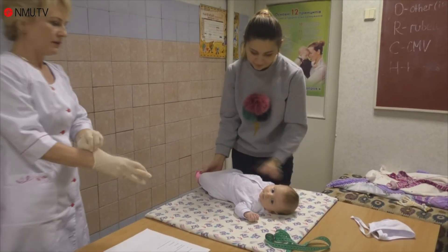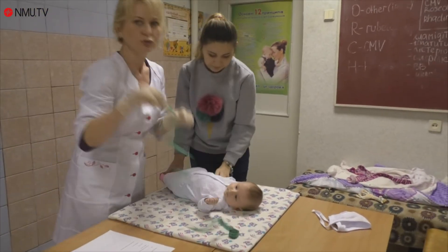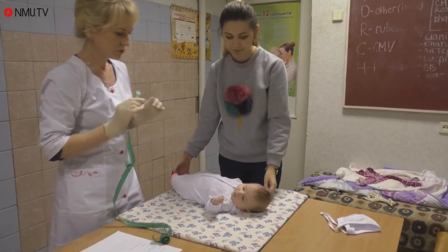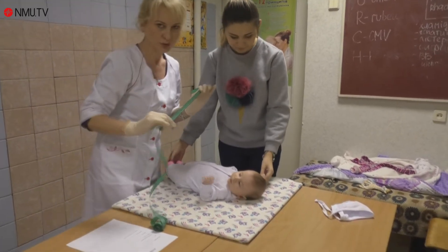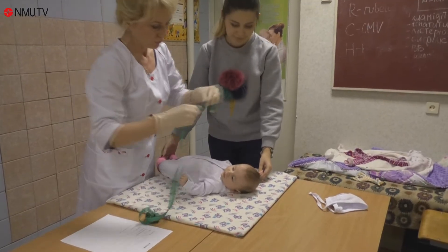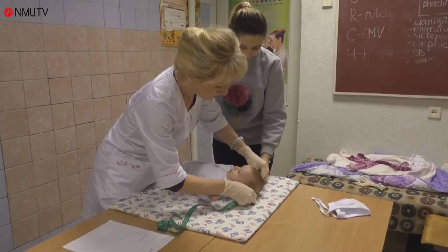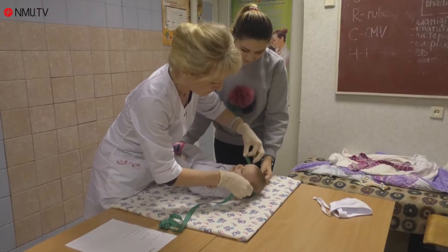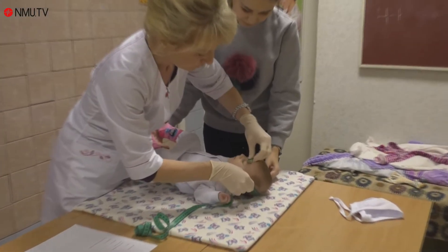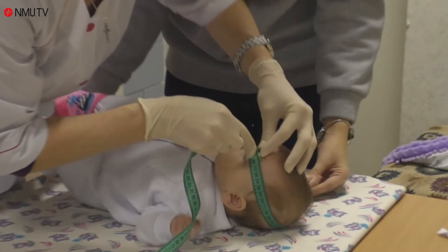For measuring, we use a centimeter tape that does not stretch. We put the tape on the child's head so that it passes behind the most protruding point of the nape and in front above the eyebrows. We are convinced of the correct application of the tape and the absence of torsion.